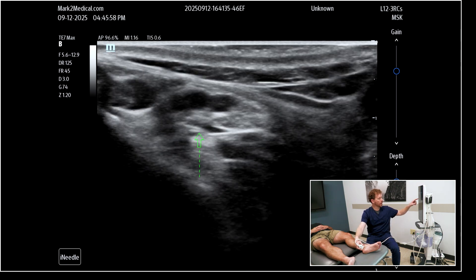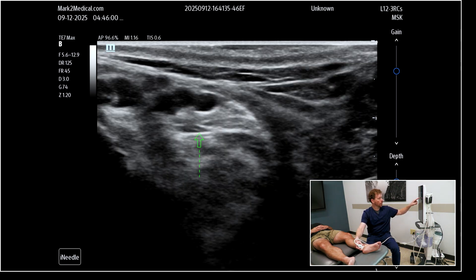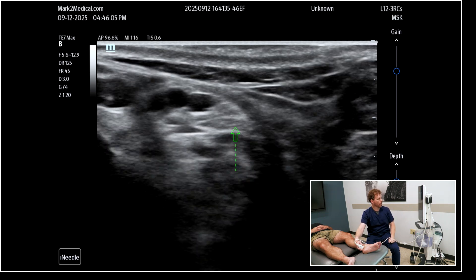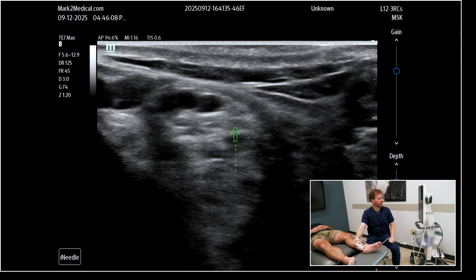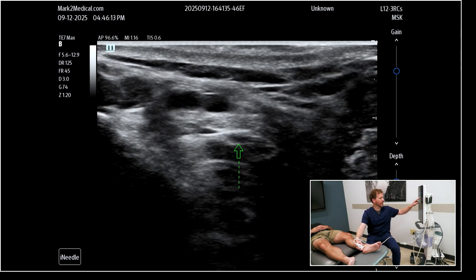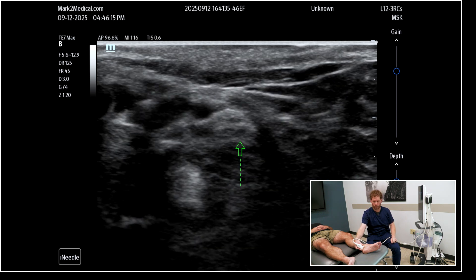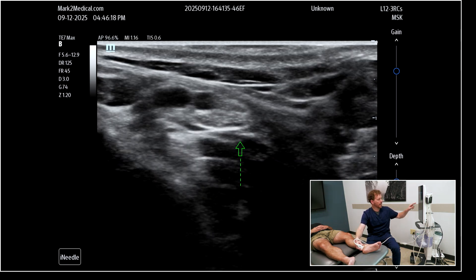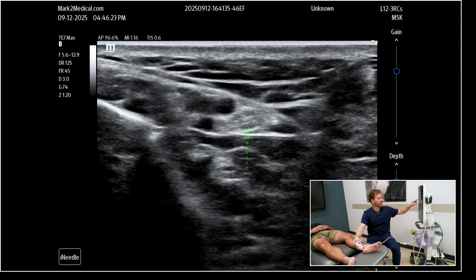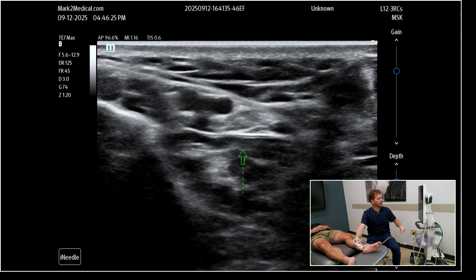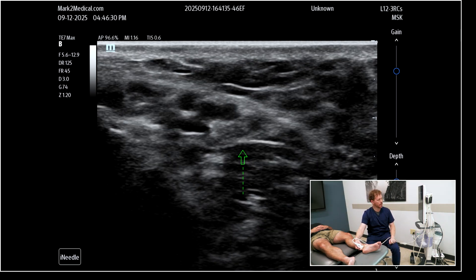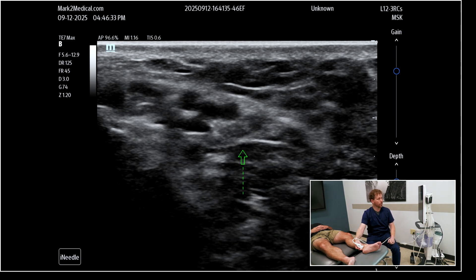On the image, what I'm looking for is a hyperechoic round structure — I'm going to put the arrow on there, hopefully your ultrasound comes with an arrow sign too, that's a joke. As I rock through this angle change, you can see how we've got the nerve in view right here and it's nice and white. As I angle further, that same exact footprint of my transducer without sliding it at all can make that nerve not quite visible at all.